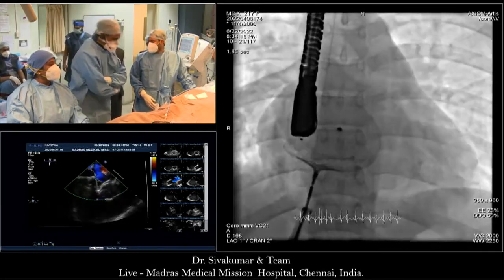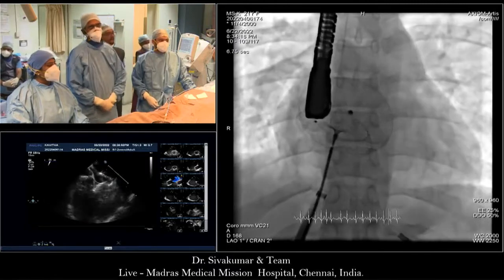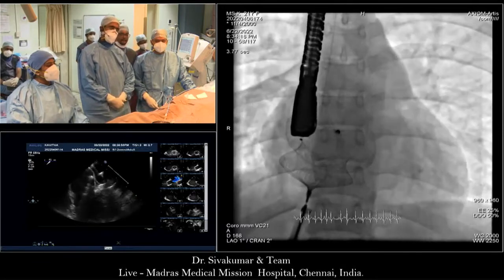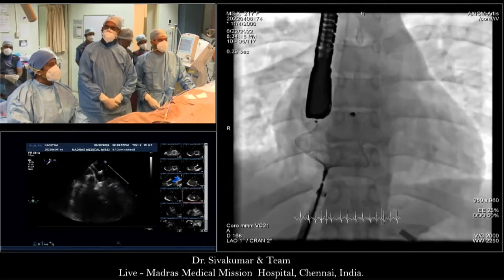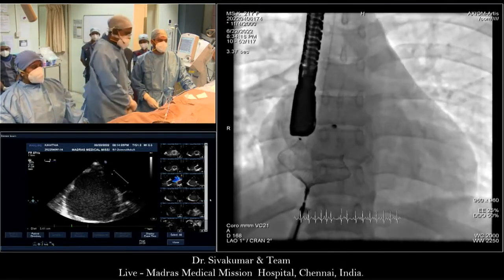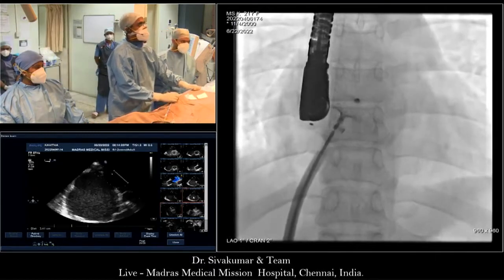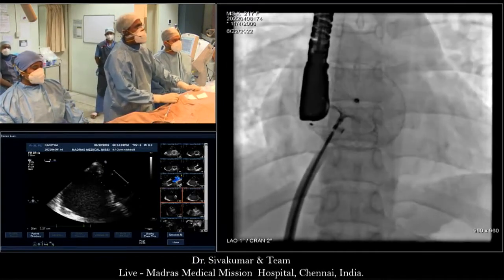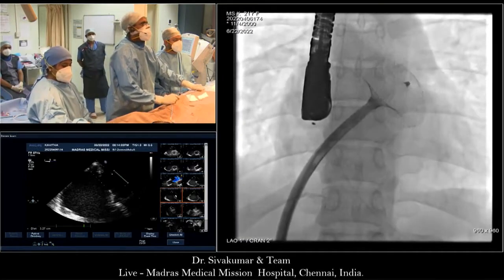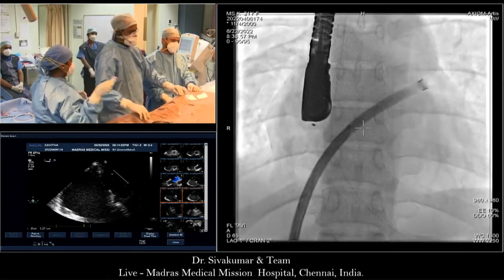Shiva, look, we have had some various discussions about sizing. The largest diameter we have had was 32 millimeters. I remember. Yep. I fully agree that with the small rim upsizing is very helpful. Get a Cocoon 36. I do not believe, and that's my humble belief, that the bigger the better. I think a little less would be better in this patient, and with your experience, I think you would have better success with a device, let's say, not 40 but 36, something like this. I will do that, Nick, now.